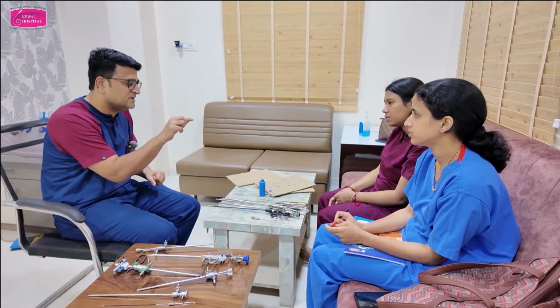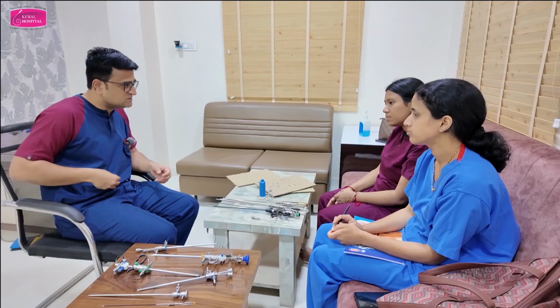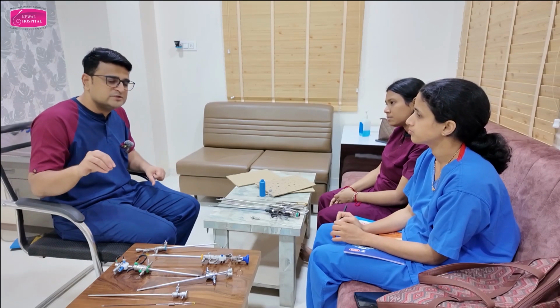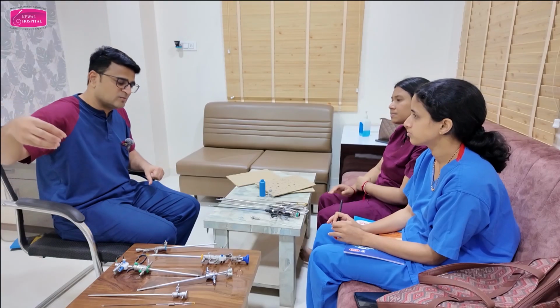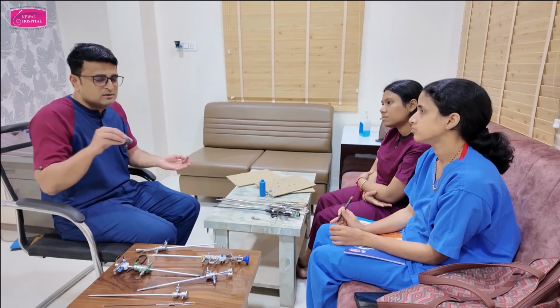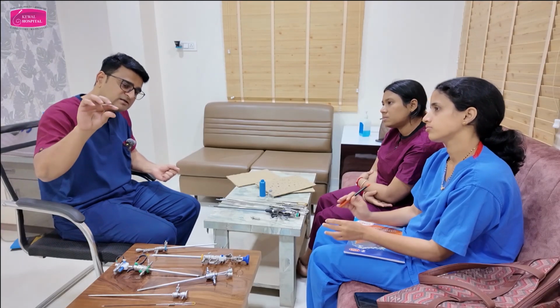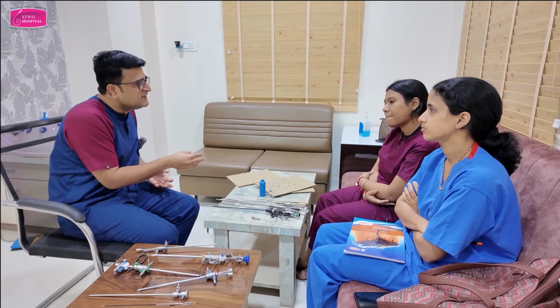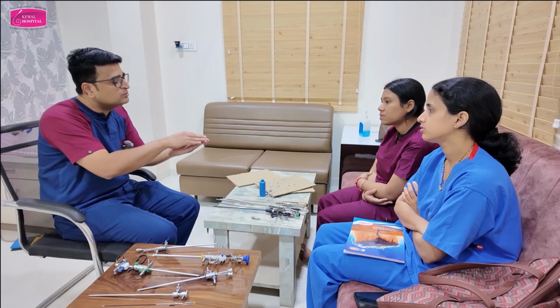Like we keep 14 pressure. Then what happens? The CO2 goes in, and once the inside pressure goes to 14, the CO2 inflow will stop. Similarly, in Hysteromat, once you set the pressure to 60, the normal saline will go in and start inflating the uterine cavity. But the normal saline is coming at a particular flow rate. Whatever fluid is coming inside the uterine cavity, half of the fluid is going out through the cervix. So it is not able to increase the pressure till 60. That is why the uterine cavity is not distending.